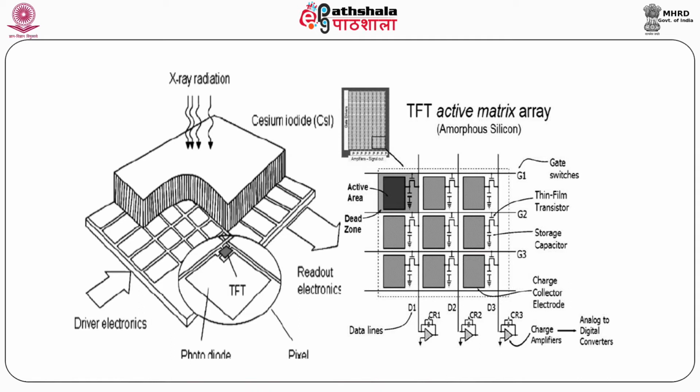Direct digital detector technology is still not very widely used. So, most of the digital radiography nowadays is carried out by using indirect digital detectors.